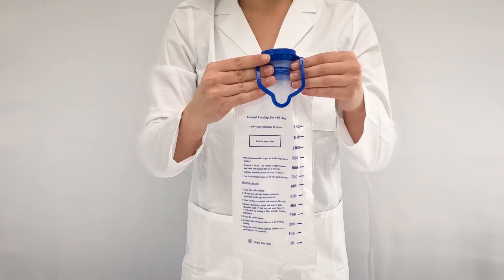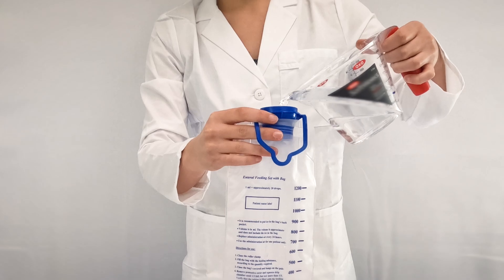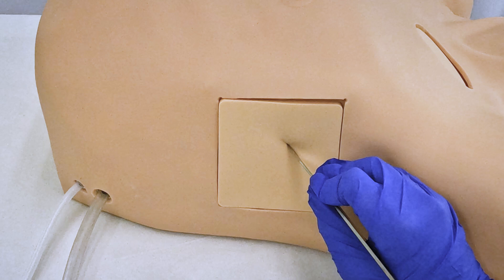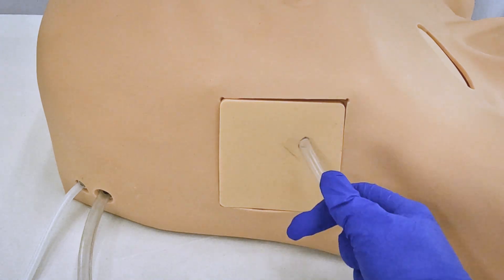To simulate chest drain, fill the reservoirs within the model with water or simulated blood. Incise the replaceable skin on the pad on the chest wall between the fifth and sixth rib and insert a chest tube.